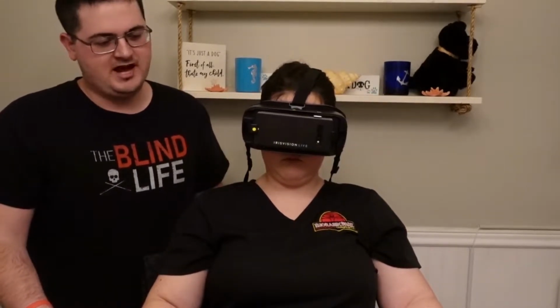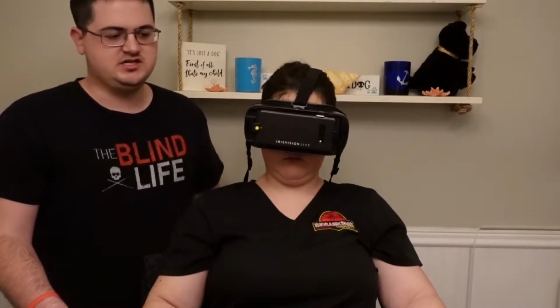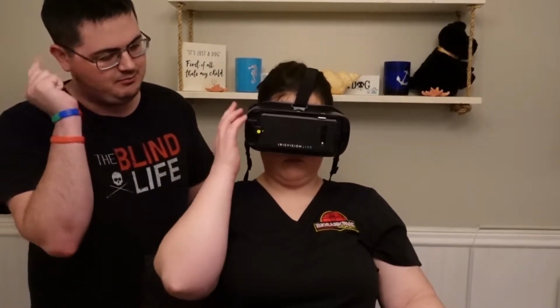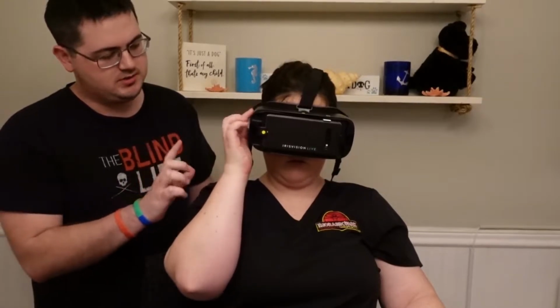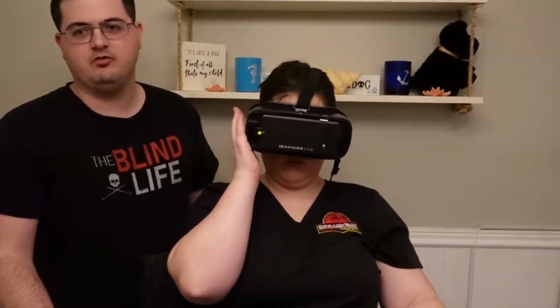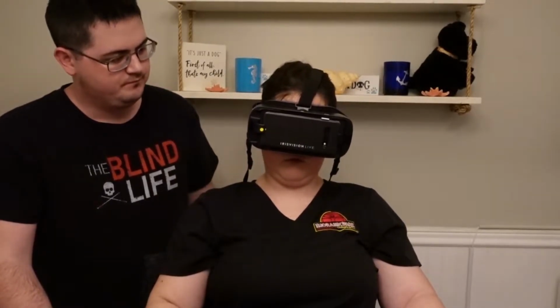Basically, the first mode after focus is scene. There are 2 ways that you can get to scene. You can either press the button on the side that's in front of the snapshot button, right here, or you can double tap the pad. It'll make a noise letting you know that you can give it a voice command. Scene. You're already in scene mode.